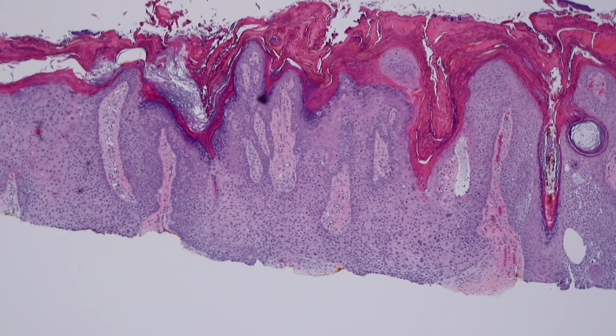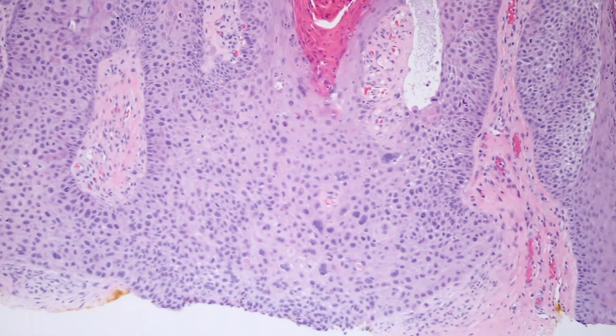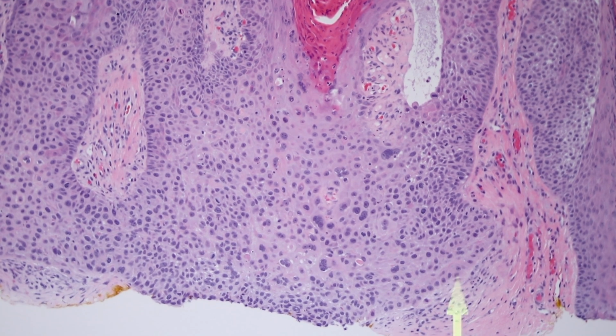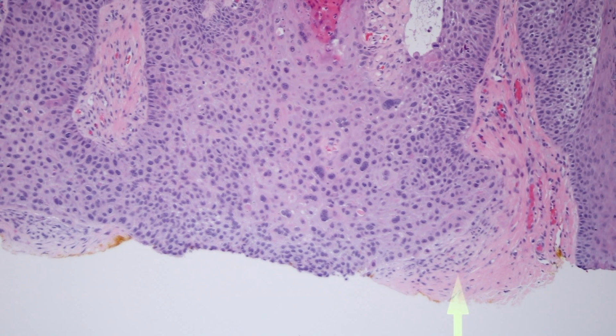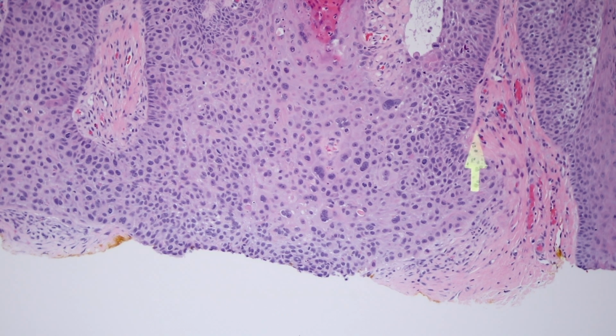All of a sudden, the keratinocytes are starting to turn really bright pink and have abundant glassy cytoplasm. So when I start seeing a lesion, either an actinic keratosis or a squamous in situ that starts getting really abundant pink cytoplasm towards the base, that starts to worry me that maybe there's invasion, that maybe this is pushing down. And the reason is that when squamous cell carcinomas invade the dermis, when they break past the basement membrane, for some reason they tend to have paradoxical maturation. They begin to not look like basal keratinocytes, but look more like spinous layer keratinocytes.